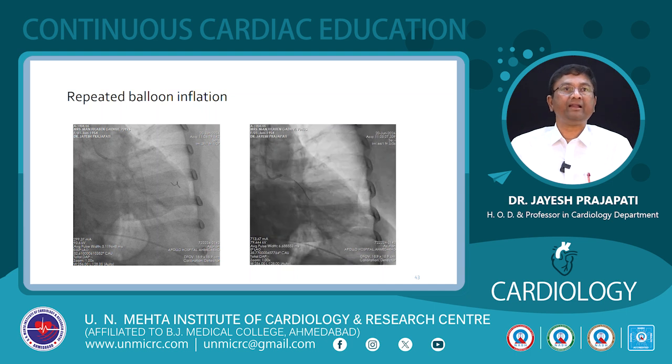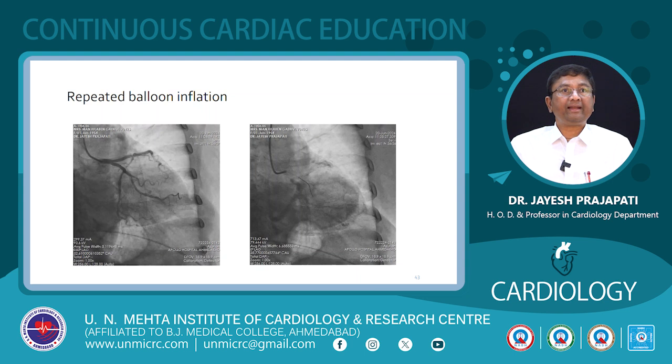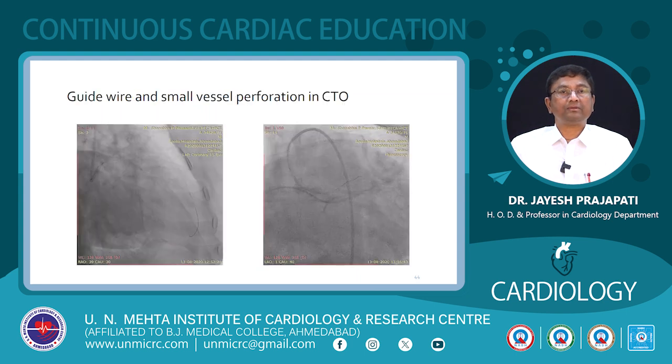So I did a repeated inflation and you see it has sealed off. Nothing else I did. I observed the patient, no pericardial collection, and it has stopped. And another, this is a wire induced perforation, type 4 perforation.